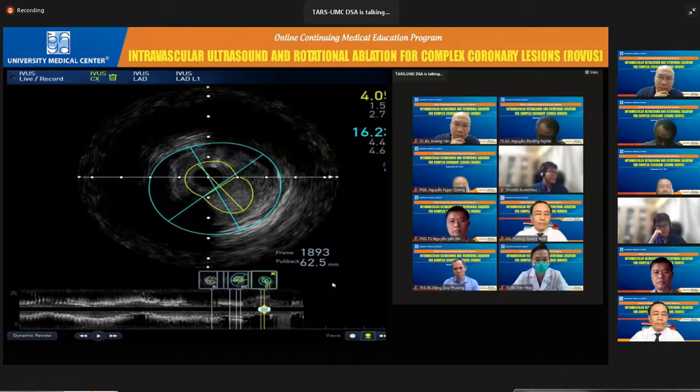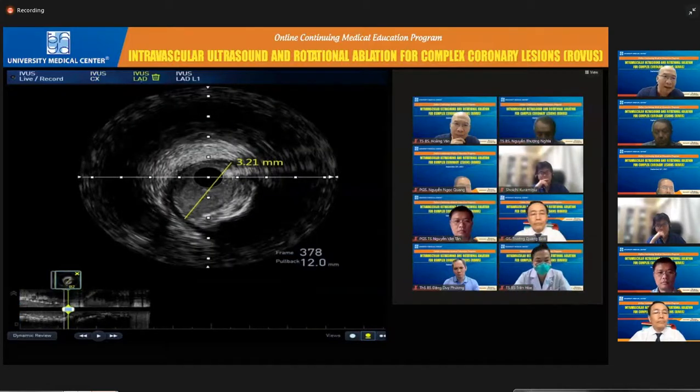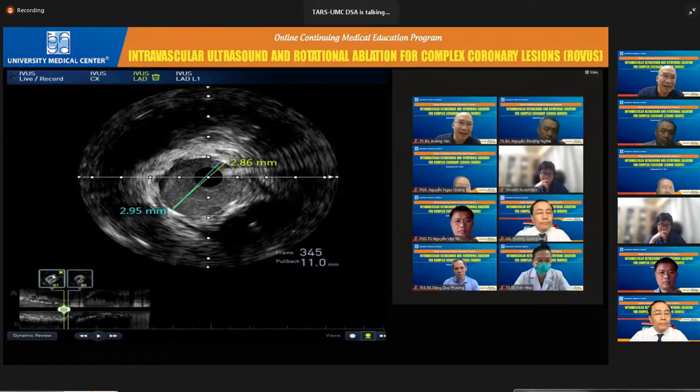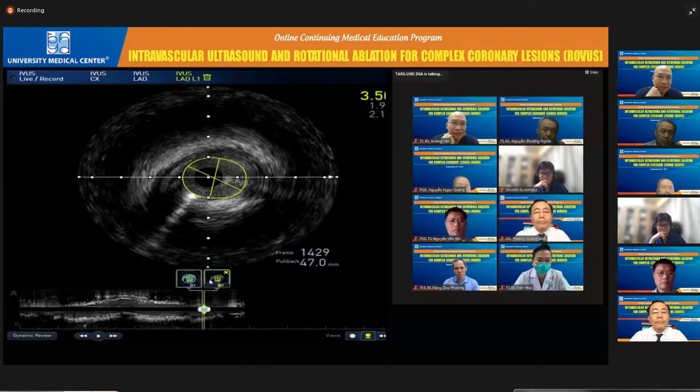So how about the LAD pullback, please? Show the left main distal diameter and MLA. Không, cái view mà anh đã đo lúc nãy á, em đã đo lúc nãy với anh rồi. Không, đó đo rồi, đó bao nhiêu? Cái này là left main LAD. LAD đâu?